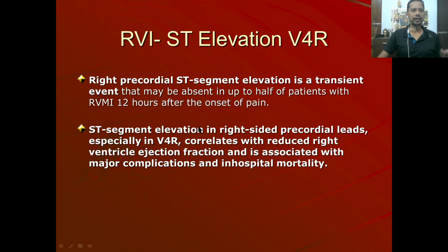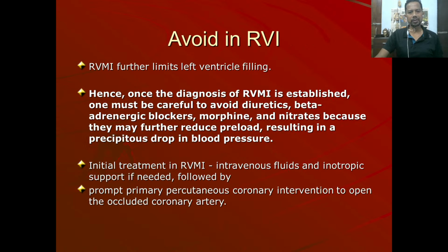Right ventricular infarction changes will be present just for a few hours. So if you take the ECG again after some time, you might miss these changes. So V3R, V4R are very important in the initial hours, and persistent ST elevation in the right precordial leads, especially V4R, correlates with high mortality and morbidity and poor ejection fraction. So the outcome is not good.